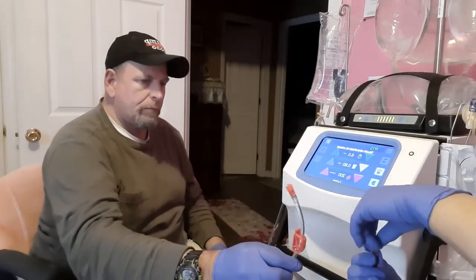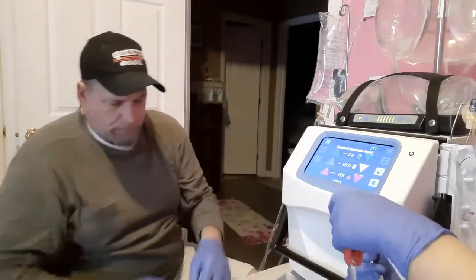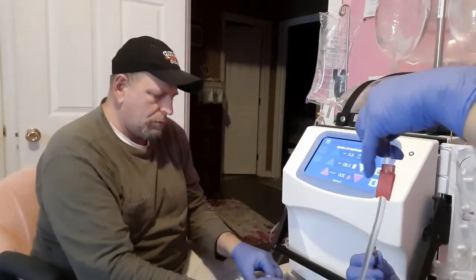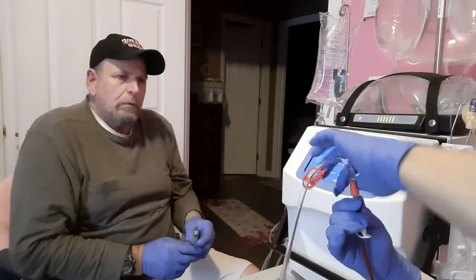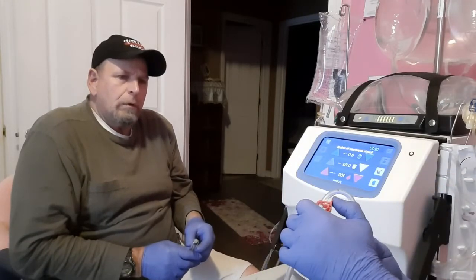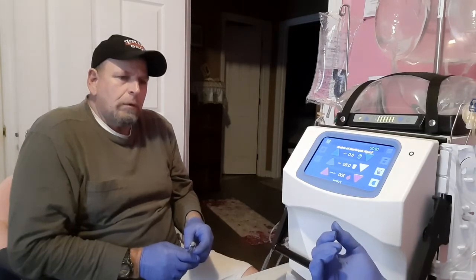He's going to hold his hand out for this. This goes into the sharps container because it has blood on it. And I always double check to make sure lines are clamped. I'm going to connect these two together. This is what I did with the venous. Okay, nice and tight. Then I'm going to unclamp and unclamp, and I'm done.